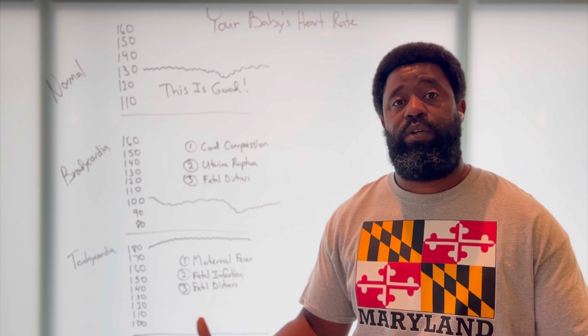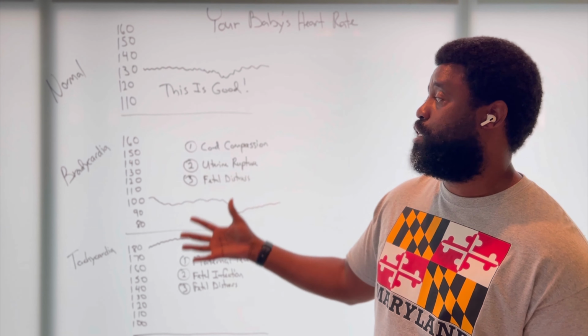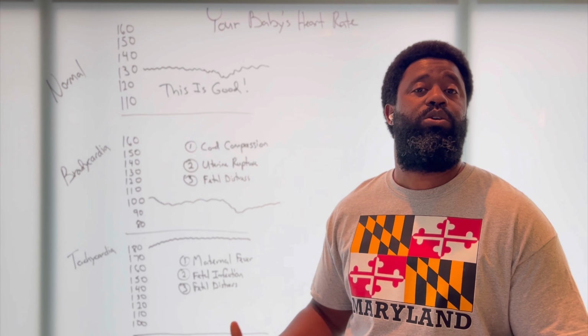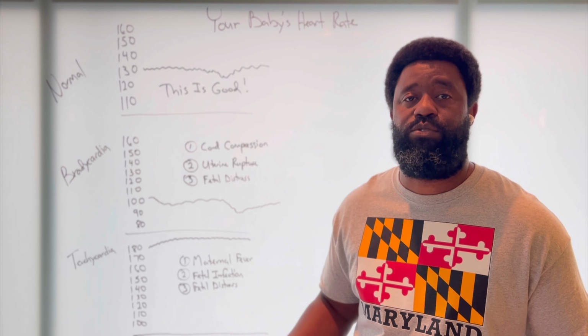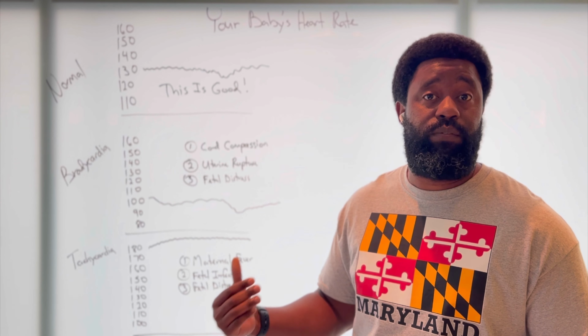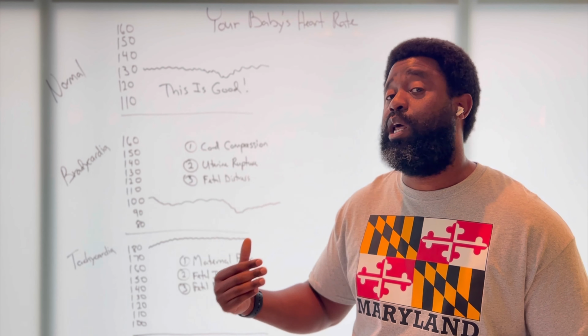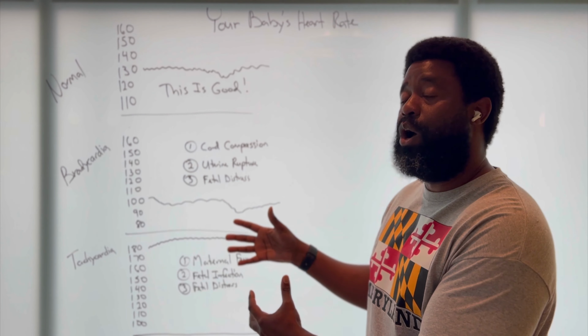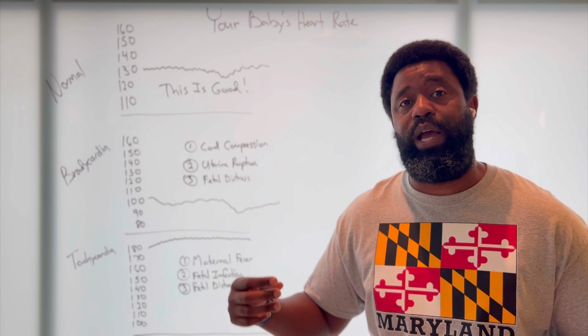Now, I'm going to put all this together. When we're helping families try to understand, okay, Mr. Boston, what caused this? Why did my baby have this traumatic brain injury? We are reviewing the electronic fetal heart monitor. We're looking at these strips because they give us a good way to put the pieces of the puzzle back together and understand what may have been going on with labor and delivery.